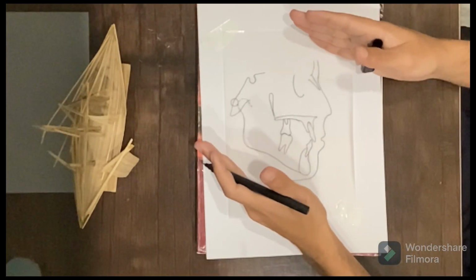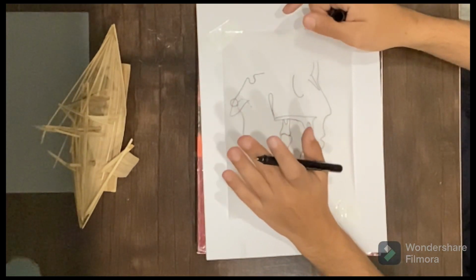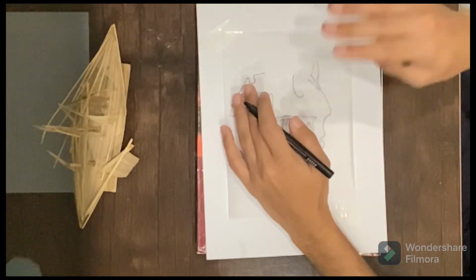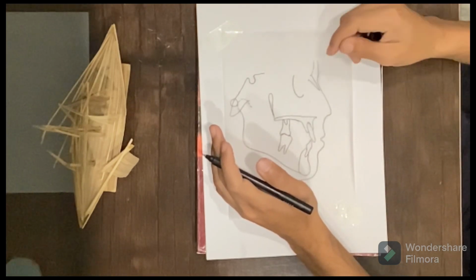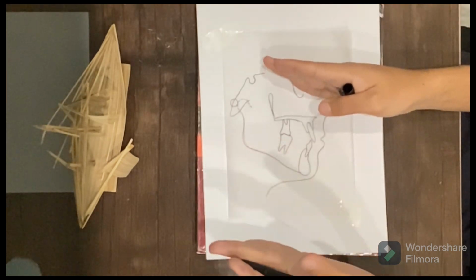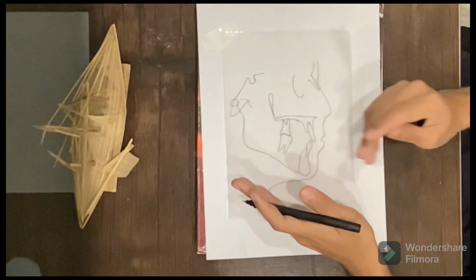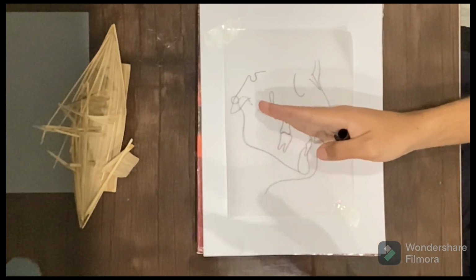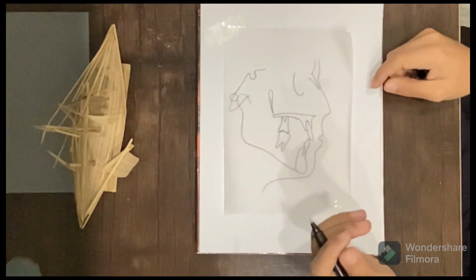The patient is positioned for the Ceph with the help of the cephalostat. The cephalostat makes the Frankfurt horizontal plane parallel to the floor, so that a proper X-ray beam can pass through the patient's skull. The distance between the patient's skull and the radiographic source must be 5 feet, which is an important MCQ that often comes in the papers, and the distance between the film and the patient should be almost 1 foot.